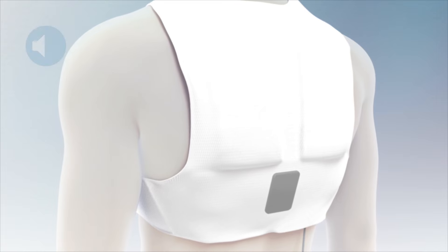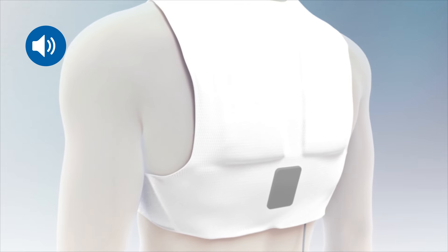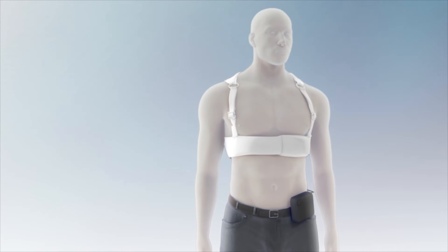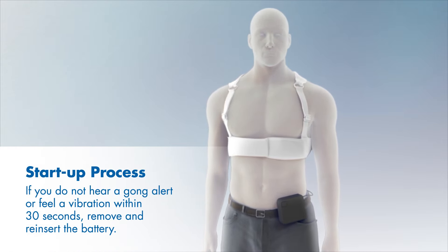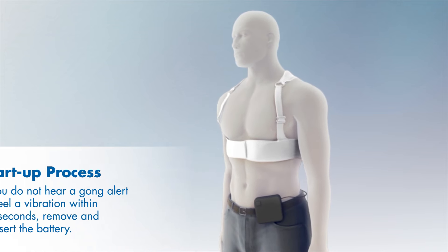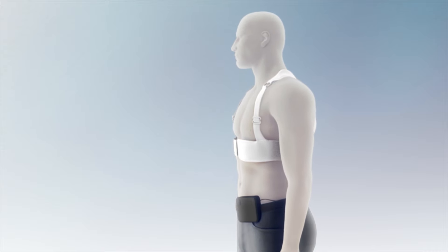You will hear a repeated gonging sound and feel a vibration. When you feel the vibration, press and release both of the response buttons at the same time to activate the Life Vest. If you do not hear a gong alert or feel a vibration within 30 seconds of inserting the battery, remove and reinsert the battery and when you feel the vibration, press and release the response buttons.